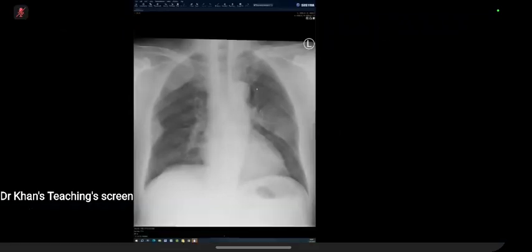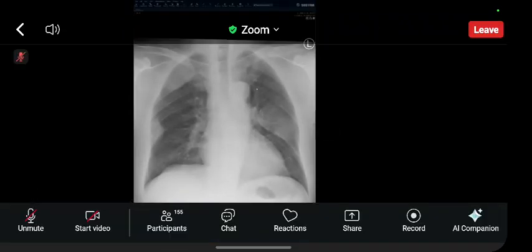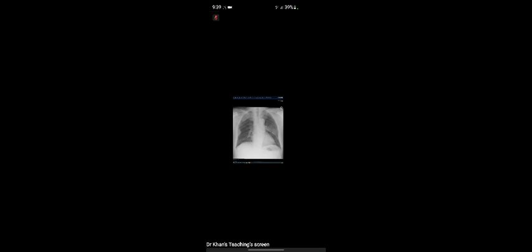Tumor that is invading the bones, and in that case there would be a wide range of differentials, depending on the patient's age. So yes, this could be a primary bone tumor as well. I don't think it's an infectious cause, and I'm not suspecting any other non-sinister pathology in this instance. Less likely primary bone. It can also be metastatic.